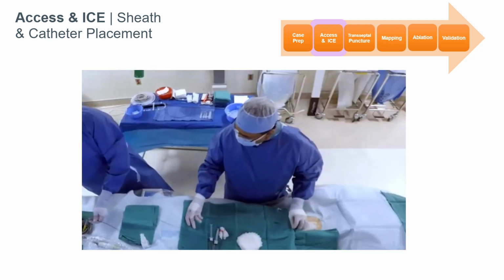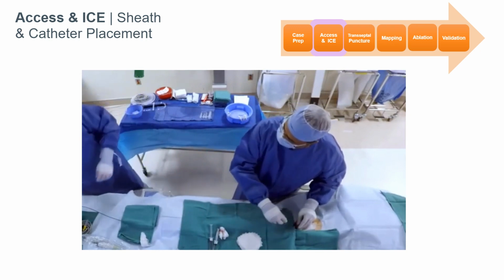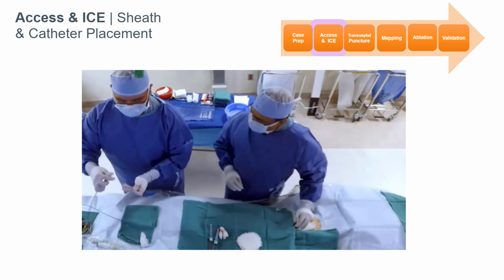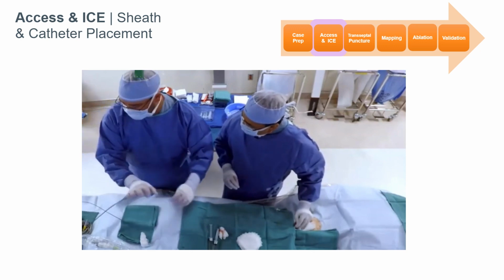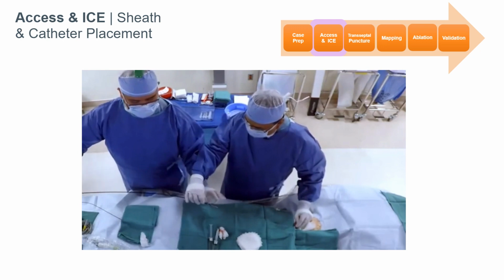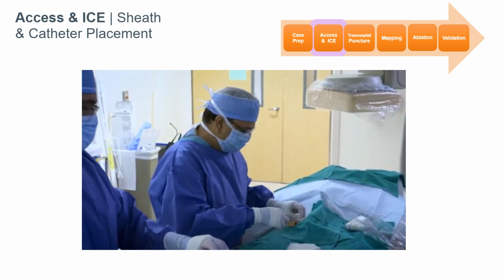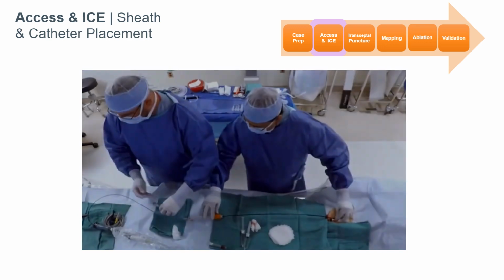Okay, going in with the VIZIGO sheath, I advance the wire in. There's no resistance. I put the wire in as far as it goes without resistance, and I just insert the sheath about 5 or 6 centimeters in, so I'm at least in the vessel, and we're just going to leave it there. Okay, so here you see the VIZIGO sheath. There are electrodes on the end so the sheath can be visualized, and it's plugged into the patient interface unit. Okay, VIZIGO sheath is in. Okay, we'll leave it like that.